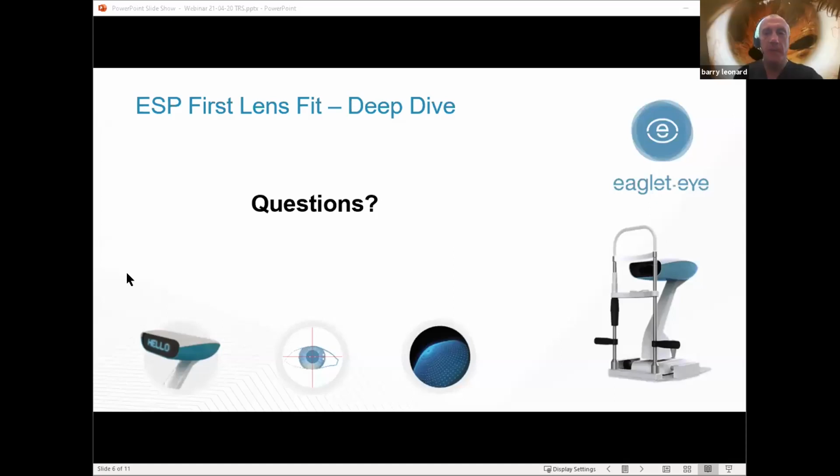Maybe before you go, I see there's a question from Karen Garcia at Boston, about image acquisition, and over the years, with dry eyes, getting a good image. The dry eye patients, in that case, she came in wearing some hybrids. Now, a hybrid lens is probably not affecting the sclera that much, but anybody who's got a large diameter lens, a hybrid or a scleral, we try to have them come back another day that they've been out of their lens.